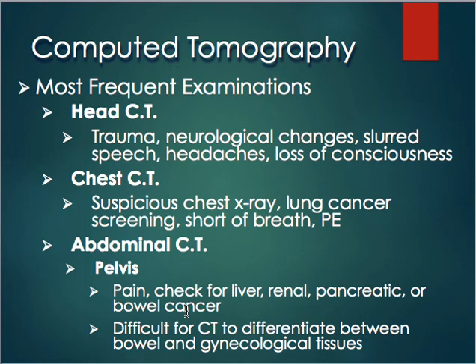Head CT examinations are of the brain and surrounding tissues. So some of the symptoms for patients who might need a head CT could be severe headache, neurological changes, slurred speech, dizziness, or paralysis, sometimes numbness, loss of consciousness, or trauma. So if somebody asked you what scan we would do if the patient had left-sided paralysis, that would be a reason for a head CT.